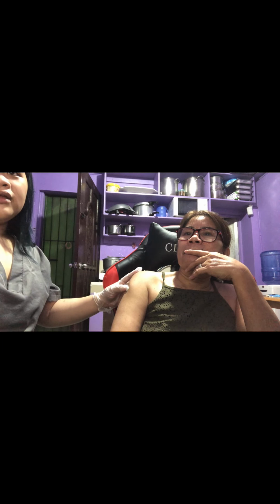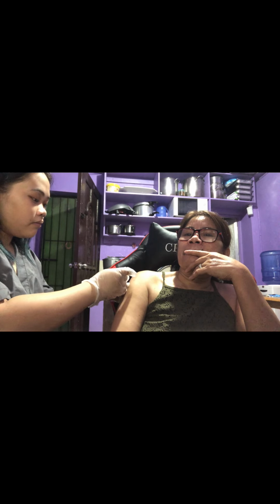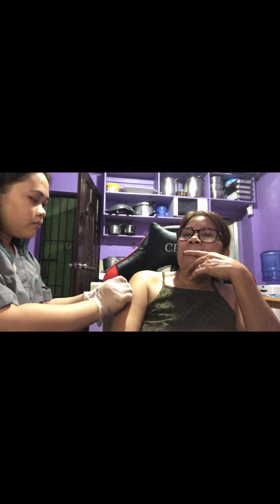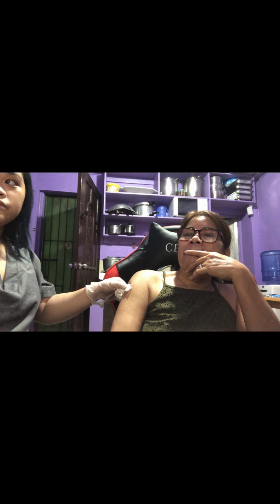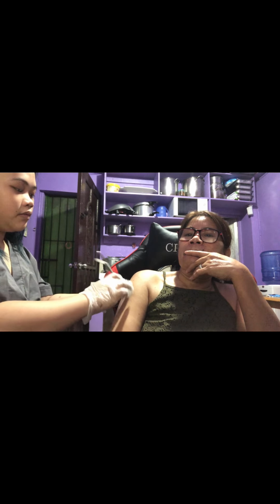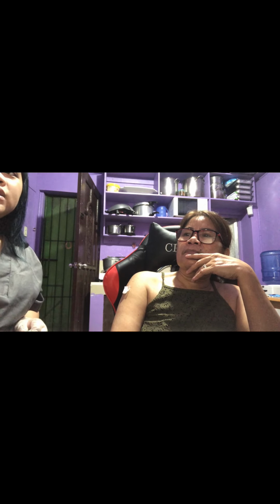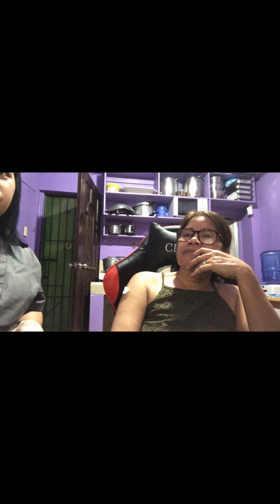And then put your tape. Always remember not to recap the needle. Dispose the syringe and needle based on hospital policy. Make the patient comfortable and document the procedure.